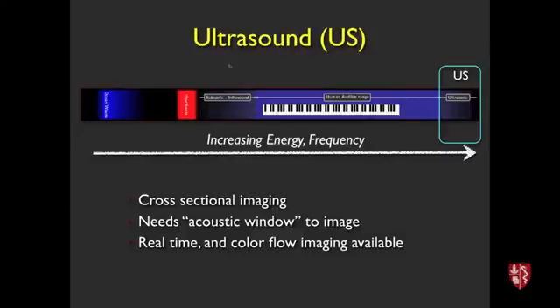So this doesn't use really electromagnetic radiation. It uses sound waves, and it's at the higher frequency end of things. It's ultra, right, above what we can typically hear. Fortunately, otherwise the ultrasound lab would be pretty noisy. You need that acoustic window. It's got some cool features like it's real time, it's very fast image reconstruction and acquisition, so you sweep along and you can see what's going on.